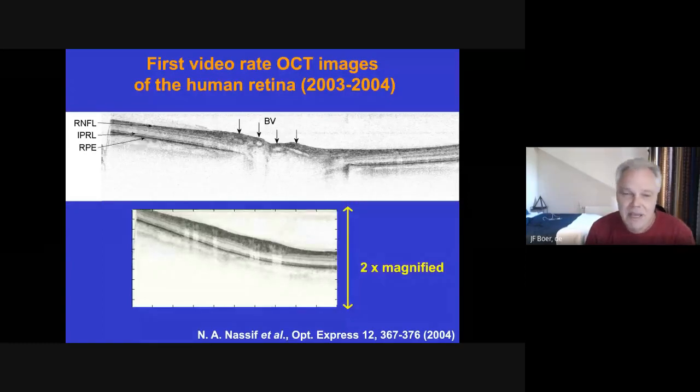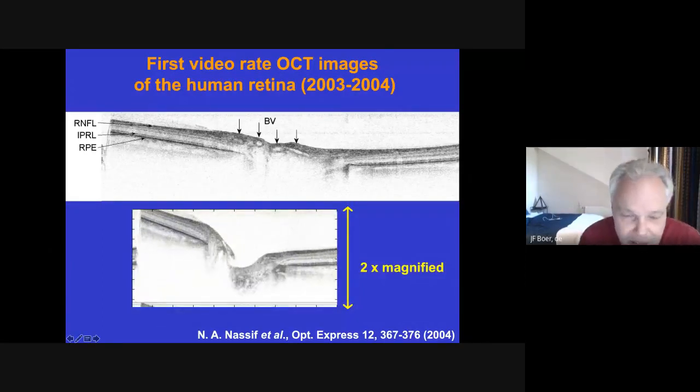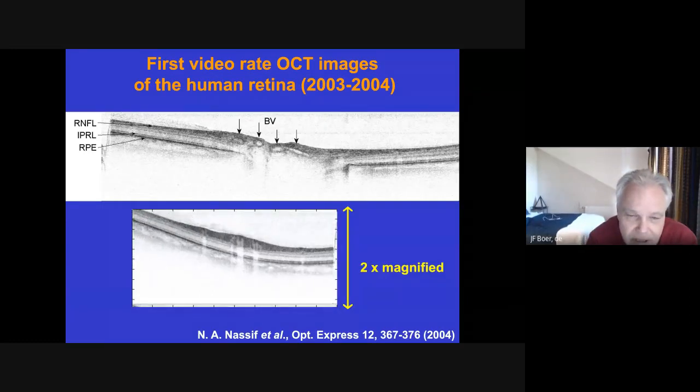So what we see now here in the video, if I hope you can see it, it will loop around, is a video rate OCT image of that, not of the fovea.